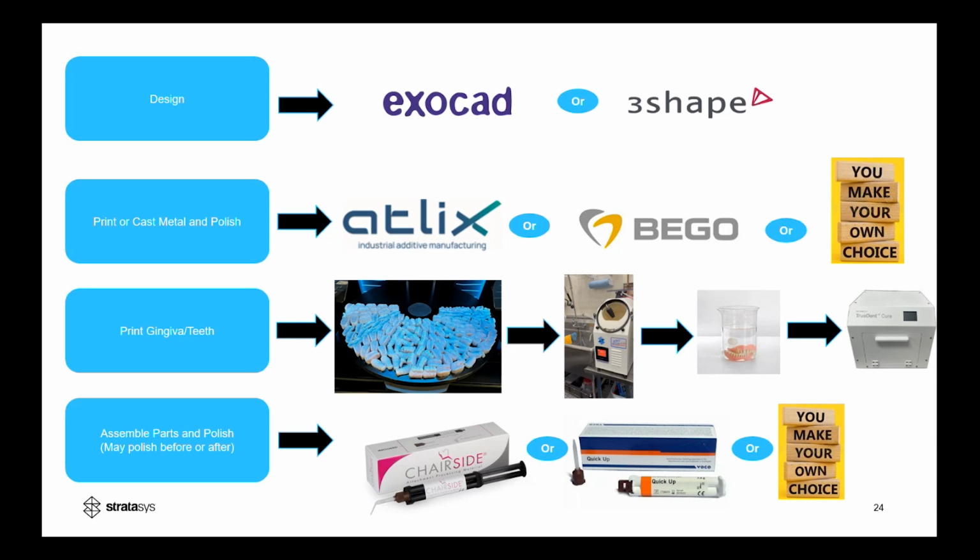Thank you. And we do have a question here about the aesthetic range of the teeth and the minimum thicknesses. The minimum thickness is applicable to the base, so it must be 2.5 millimeters at delivery. So just my recommendation about this, from being in the lab and working on a lot of these products, is when you're designing, you want to take into account your polishing or any adjusting that you're going to be doing, and make sure it doesn't go home with the patient at less than 2.5 millimeters, okay? So what I would say is 2.75 or greater, just to allow for any adjustments that need to be happening or the change of geometry during polishing.